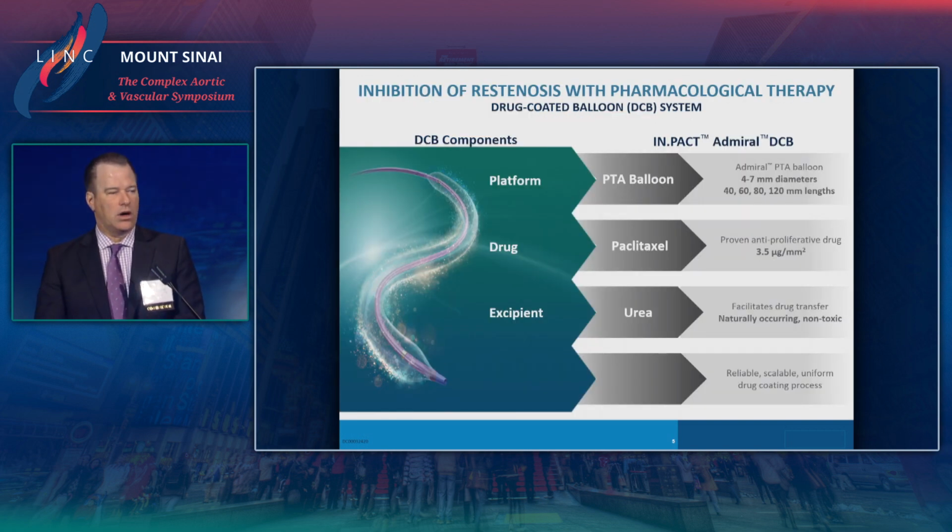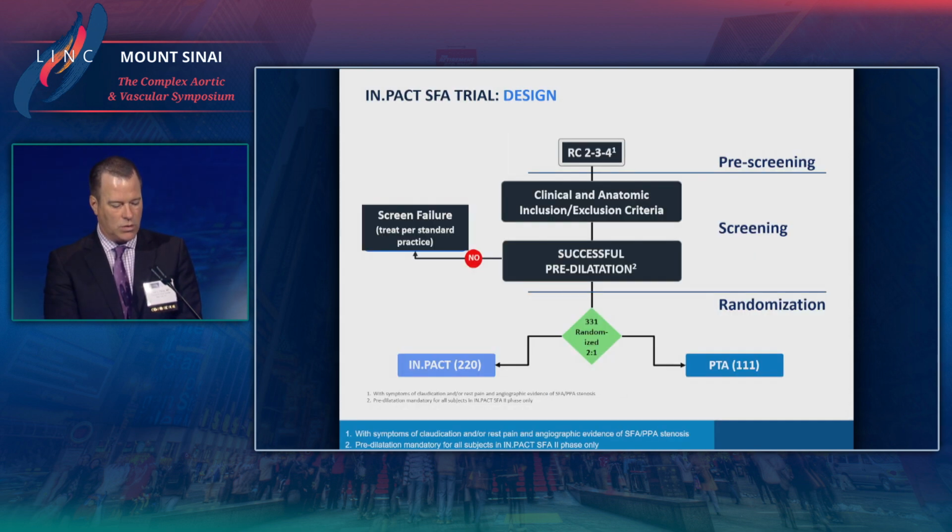Drug-coated balloons are really multiple components. There's the platform itself, which is the balloon. There's the paclitaxel, which is the agent responsible for the cytotoxic activity. And then there's the excipient that transfers the paclitaxel from the balloon through the aqueous environment into the vessel wall.